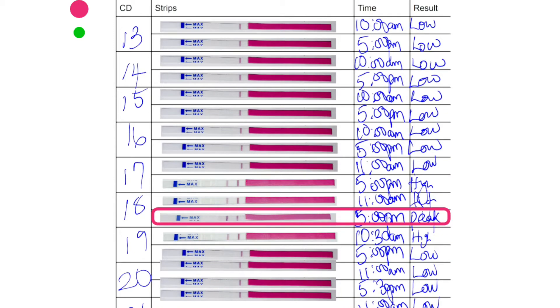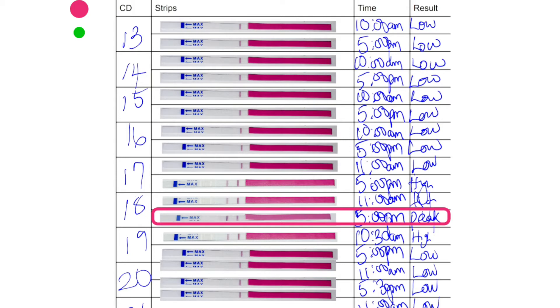So the first column on the left is labeled CD, short for cycle day. Cycle day 1 is the first day you bleed. And of course, this column is here so you know which day you are testing. Now, the next column is for the strips where you just stack them up after testing so it's easier for you to see your results clearly.